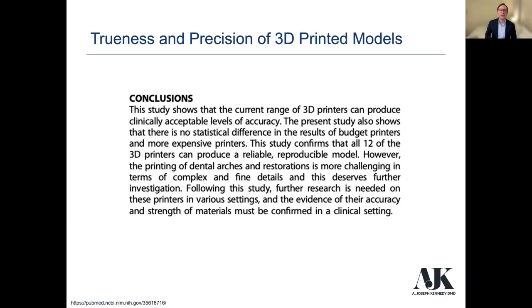But the conclusion is that the current range, and this is again just a few years ago, of these 3D printers can produce clinically acceptable levels of accuracy. They show that there's no statistical difference in the results of some of the budget printers and the more expensive printers. This study confirmed that all 12 of the 3D printers can reproduce a reliable, reproducible model.